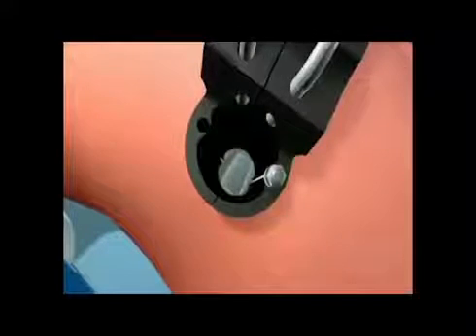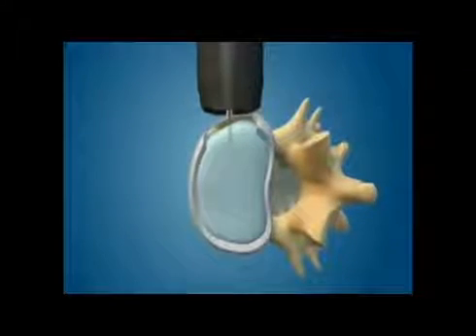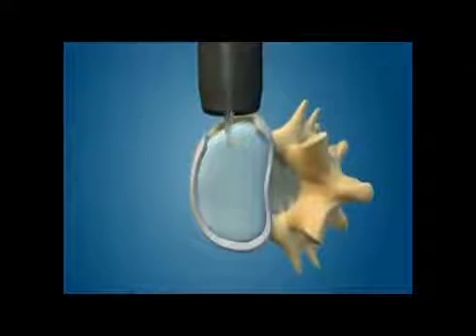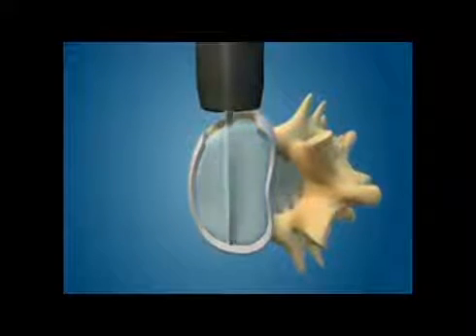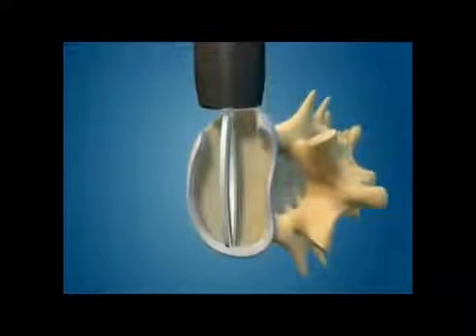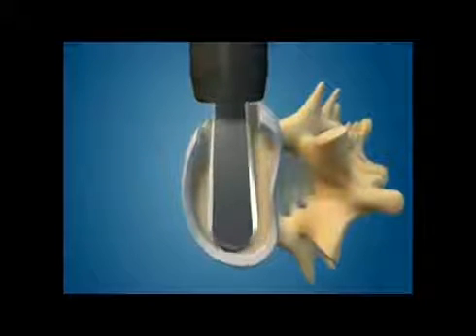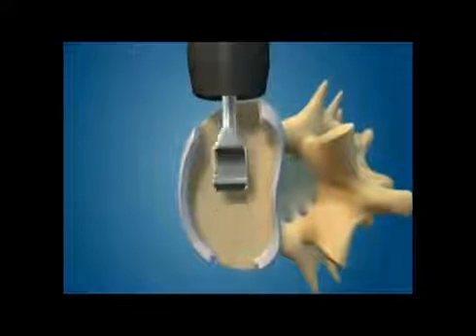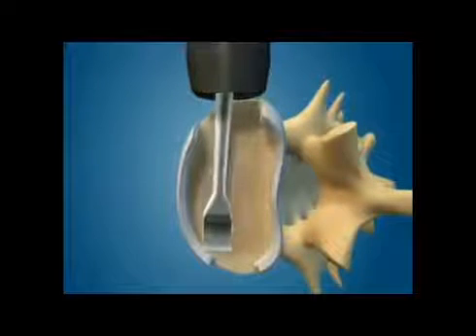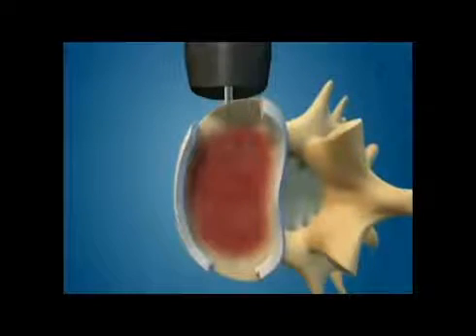As the material is removed, the opening is enlarged to allow for the rest of the disc material to be removed and the endplates of the vertebrae to be prepared for the fusion. This involves the use of several different types of instruments, all being placed through the same small opening. The bony endplates are then prepared for the fusion, removing all cartilage.